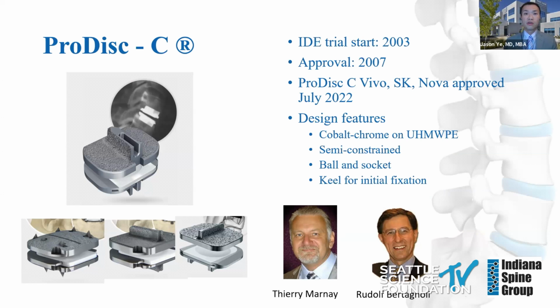While the Bryan disc used a semi-spherical reaming device for initial fixation, the ProDisc-C used a keel. This allowed it to skip the cumbersome milling step and use the keel cutting step instead. Approval was obtained in 2007. In July of 2022, the next generations of the ProDisc, Vivo, Nova, and SK, were approved.